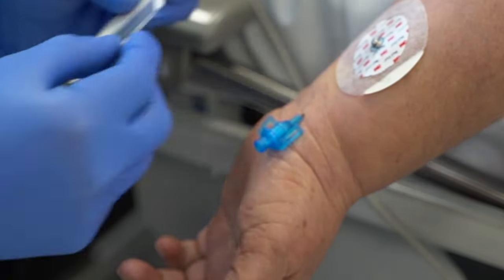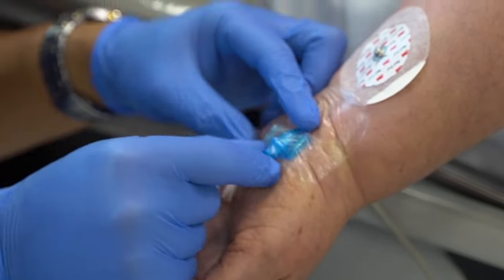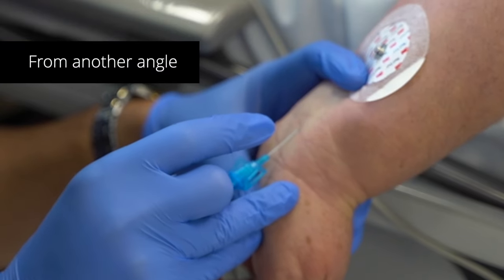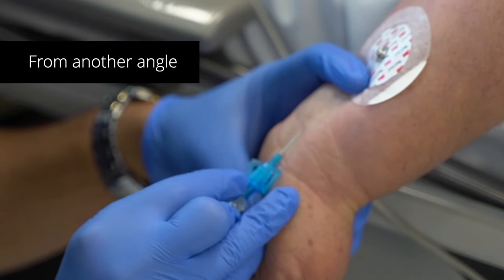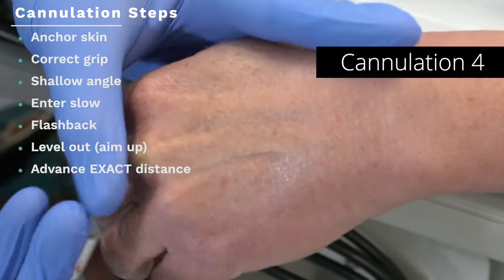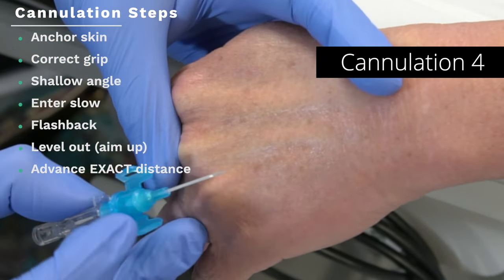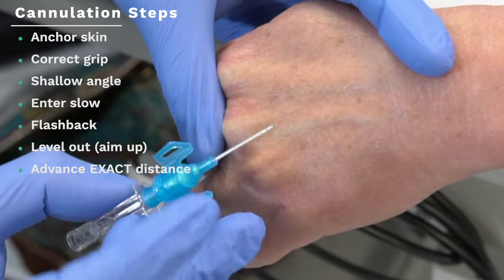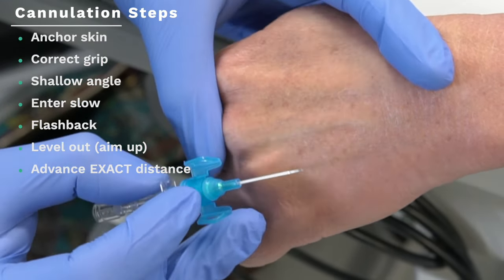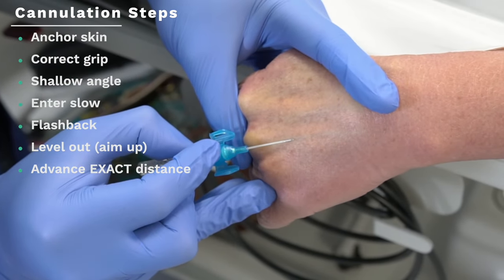Whichever site you put a cannula into, you want to review that cannula every day, make sure it's working, and make sure that each injection is also working. This next one wasn't exactly a difficult cannula — it's a very visible vein where I could probably put a 20 or even 18 gauge through. But just for the purpose of demonstrating, you can see that my knuckle for tensing the skin is over the ridge of the knuckle so it doesn't impair my low angulation of the cannula.